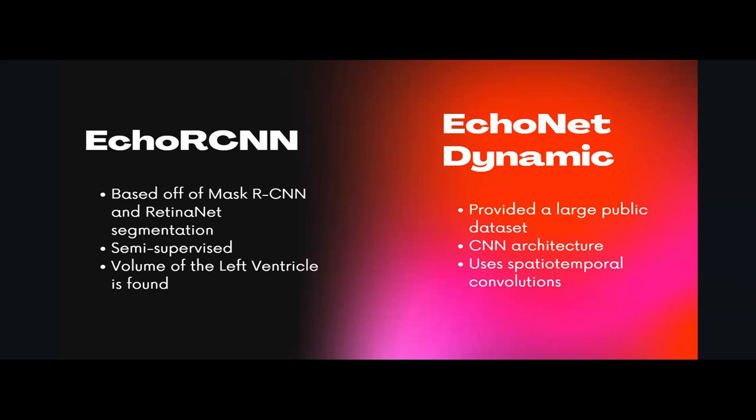The EchoNet dynamic is they publicly released a data set of about 10,030 annotated echocardiograms, which significantly promoted the research on this because one of the main issues with conducting this research on the chamber segmentation was that there was a lack of public data sets. And so EchoNet Dynamics has that, and they publicly released it. And they use CNN architecture, and they use spatiotemporal convolution, which is new to medical imaging because, like I said, there isn't a large amount of medical videos that are labeled.